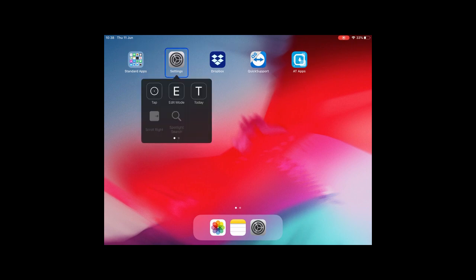When you press the switch on a highlighted item, it'll bring up a scanning menu. This menu enables you to navigate and control other features of the iPad, but can be turned off if preferred. To then enable the item to be tapped on, you select the item Tap in the scanning menu with your switch, which can be seen in the top left corner of this menu.